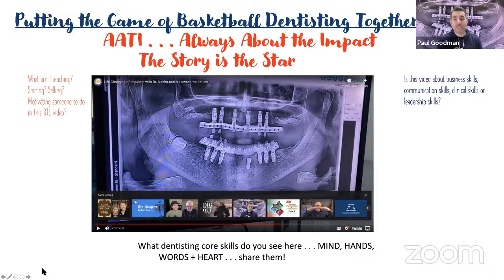There are so many different schools of thought on when to remove these. Some people do it every 6 months. To me, it depends on how well the patient takes care of it. This patient is meticulous about it. You're going to meet a patient soon who is not, who strived very hard to take care of theirs, but it was a tougher case to take care of. So right then and there, these are some take-home points.